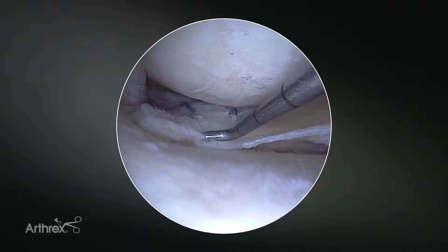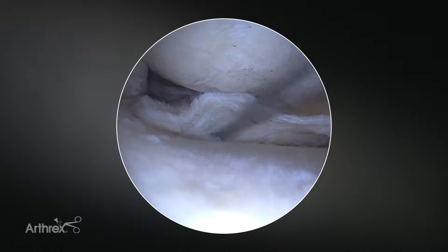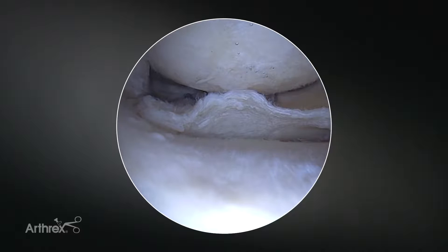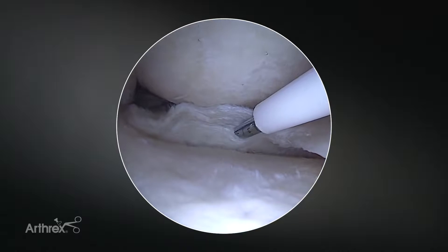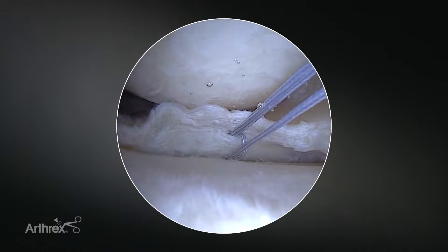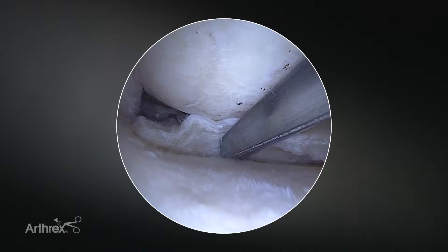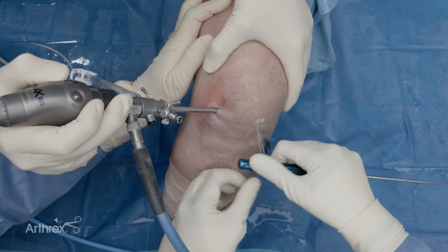Our femoral sutures have been placed and have tensioned down that meniscal repair. Now we're going to address the tibial side portion of the tear. For this length of tear, I'm going to use two fiber stitch implants, as it's not quite as long as the femoral side. We're going to start again from peripheral and go centrally. Because the tissue is everted like this, we're going to easily puncture the tibial side. Just like before, we set it and clamp it. We take our sled, slide in more centrally, protect those previous sutures, and get our next implant. We grab them all, set, and then take the probe and tension this down.